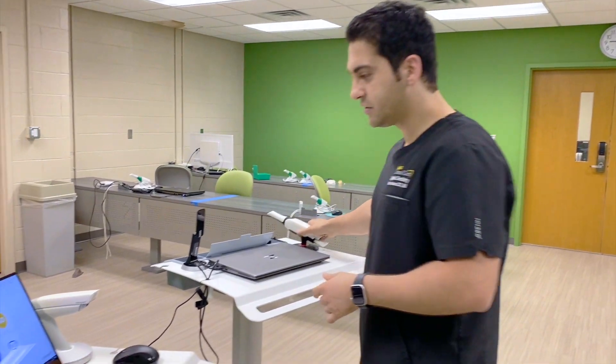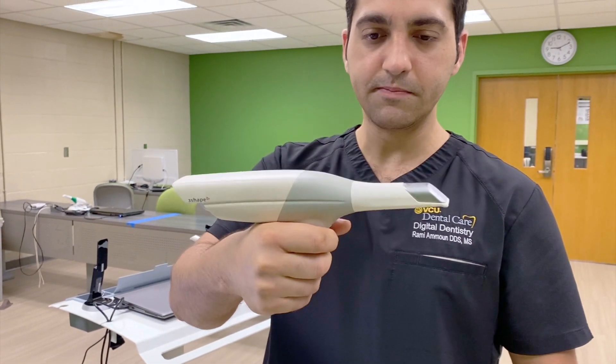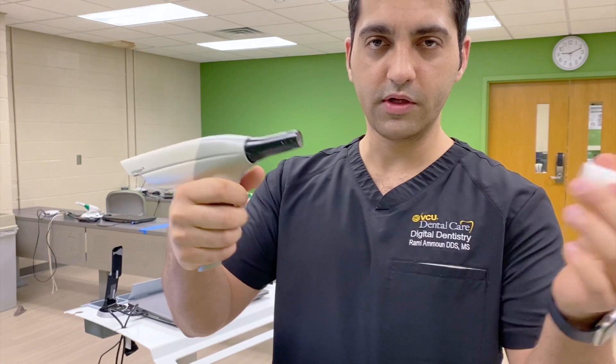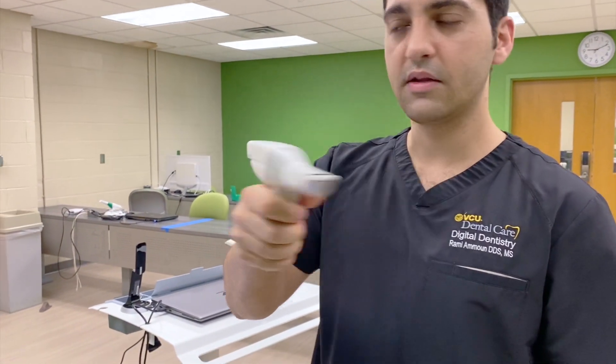For the Trios 3, as I just showed, the tip goes like this. If you're doing the mandible, you're going to hold it like this. For the maxilla, you're not going to twist it — you're just going to pull it. And this is how you're going to hold it to scan the maxilla.